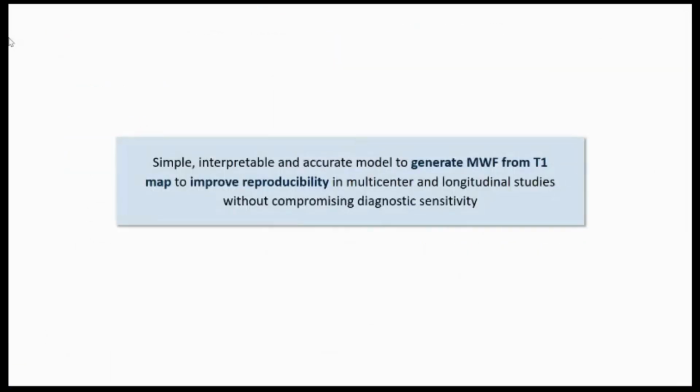So we proposed a simple, interpretable, and accurate model to generate myelin water fraction from T1 maps to improve reproducibility without compromising diagnostic sensitivity.